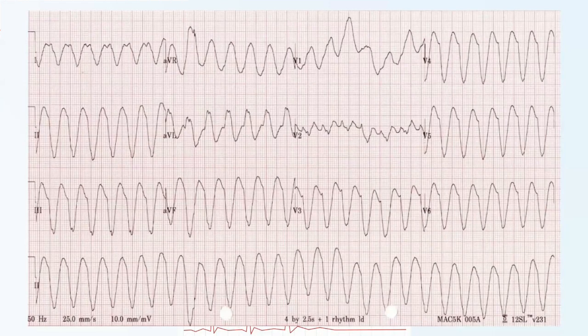Here's a 12-lead of a VT. You can see it's a monomorphic VT. The QRSs are equal amplitude, usually caused by things like ischemic heart disease, DCMs, HOCMs. If there's impaired cardiac output, you need to treat these with cardioversion. Otherwise, it may degenerate into ventricular fibrillation, and there's high mortality associated with that.